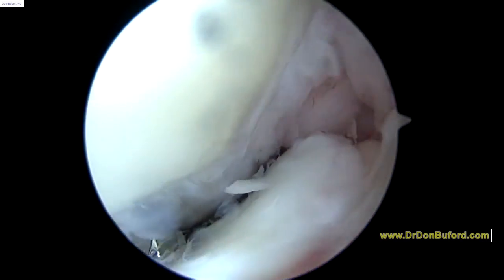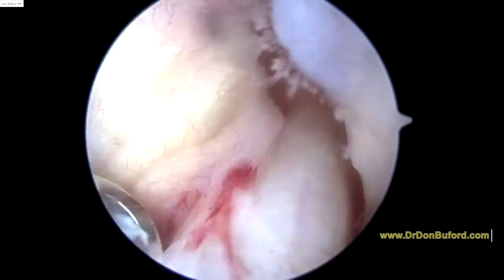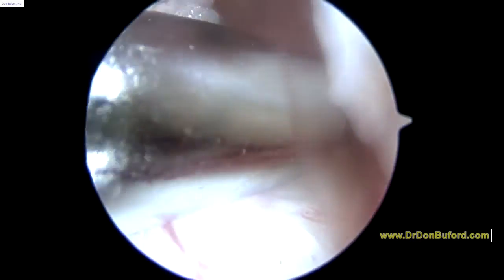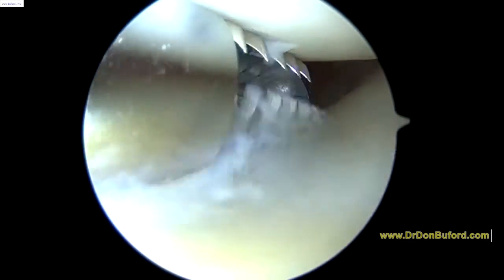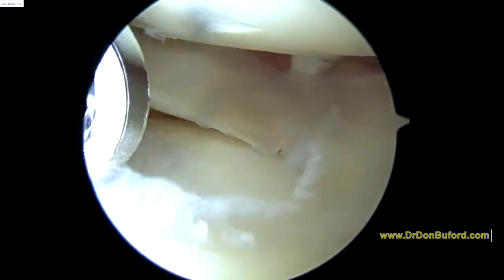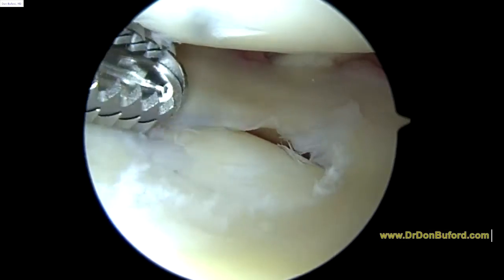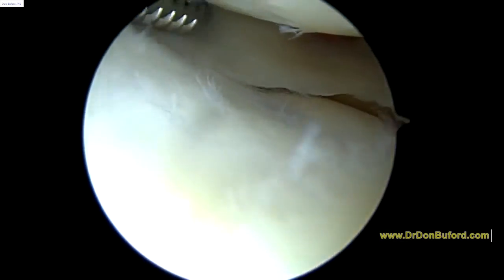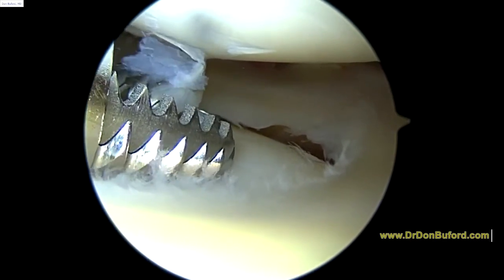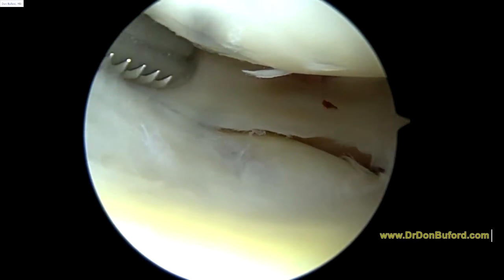Now as we look at the notch here, we'll hopefully see a good-looking ACL, and indeed it looks fine. Instability has not been the issue clinically either. So we are looking at the lateral meniscus, and we're just trimming the inner edge at this point. I don't see a significant tear. This compartment is in a little better shape than the medial compartment — maybe one grade better.